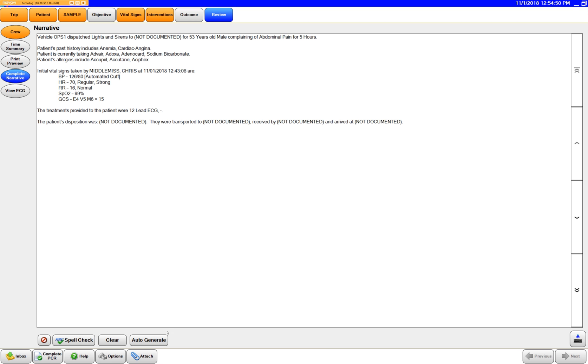It's going to bring in your response mode, age of the patient, and chief complaint. Going to bring in their history, current meds and allergies, and their first set of vital signs recorded off of your primary assessment.